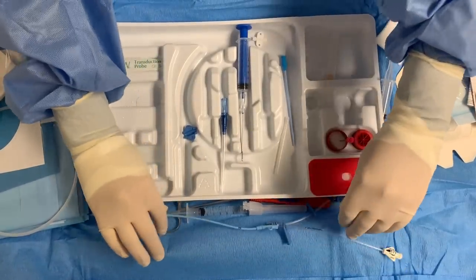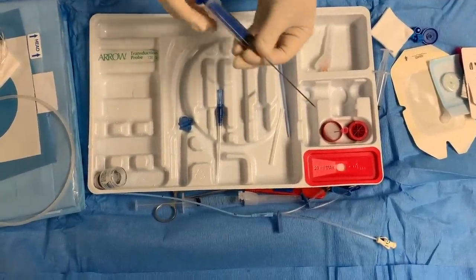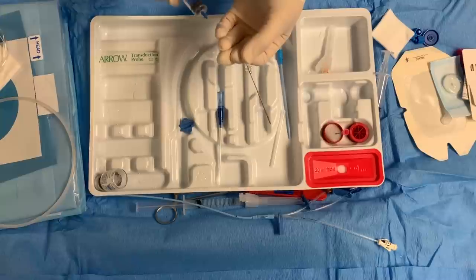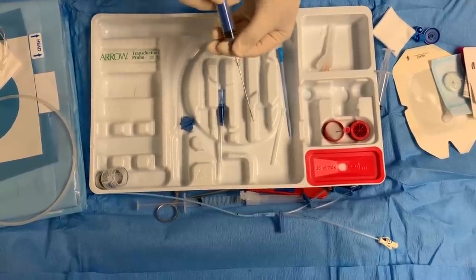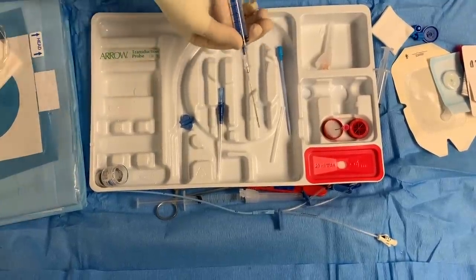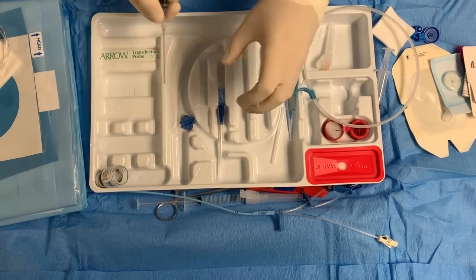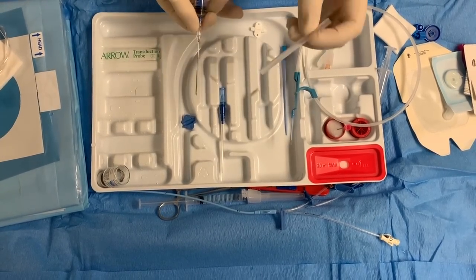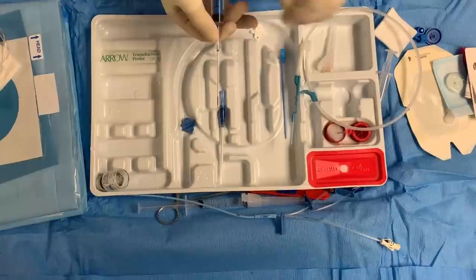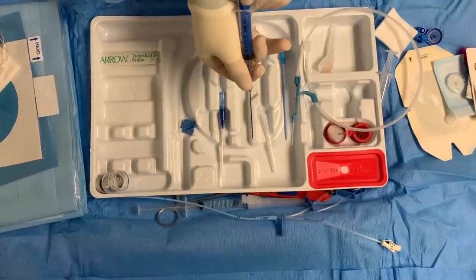So then you have your things aside. Here's your needle. Some people like to take it out once it's in the vessel and then put in the guide wire, but that's going to be tricky, so I'd keep it on nice and tight. What's going to happen is you go into the vessel. Once you're in the vessel, somebody is going to show you with the ultrasound where the vessel is. I like to use this little tip — it'll tell me exactly where that vessel is. I'll push on it, make sure I'm there, and with the needle, I point down and go down and pull back and aspirate until I see blood.